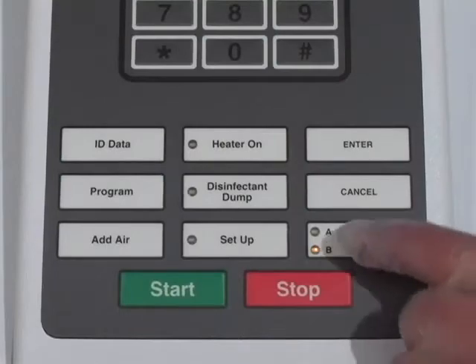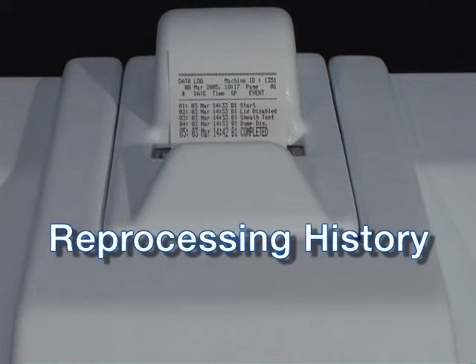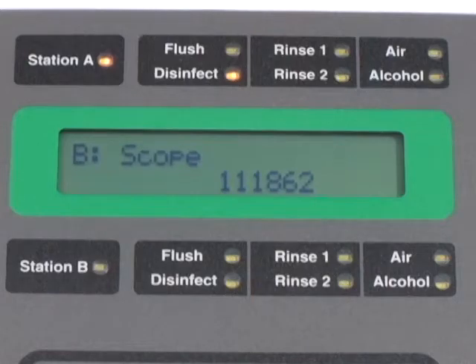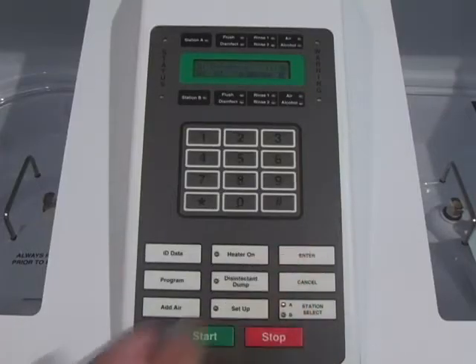Press the station select function key on the control panel. If you are using the left basin, select Station A; if you are using the right basin, select Station B. Most owners take advantage of the DSD-201's ability to provide printed documentation for each reprocessing cycle. The information recorded can be the endoscope serial number, operator ID, patient ID, and physician ID. This feature can be skipped or some fields can be skipped by pressing Enter to pass unused fields.